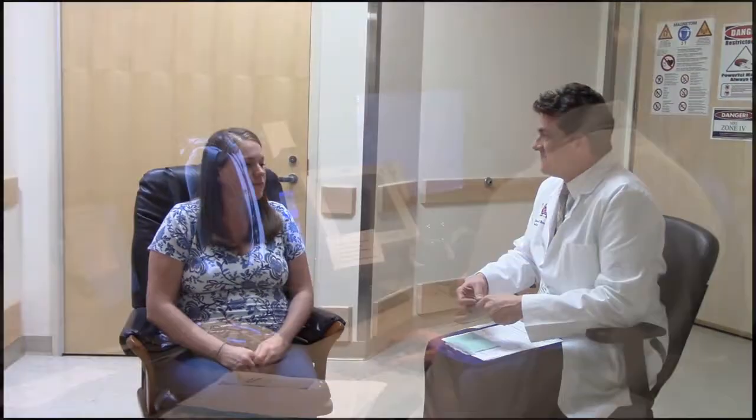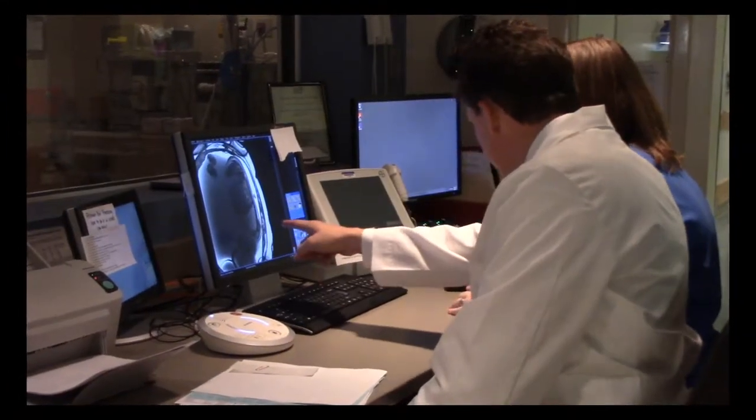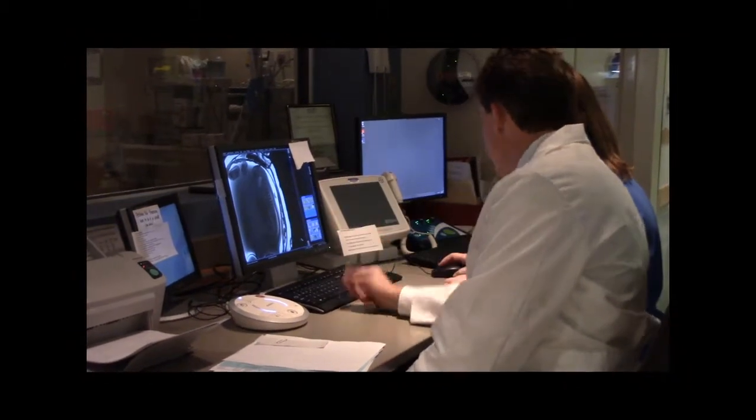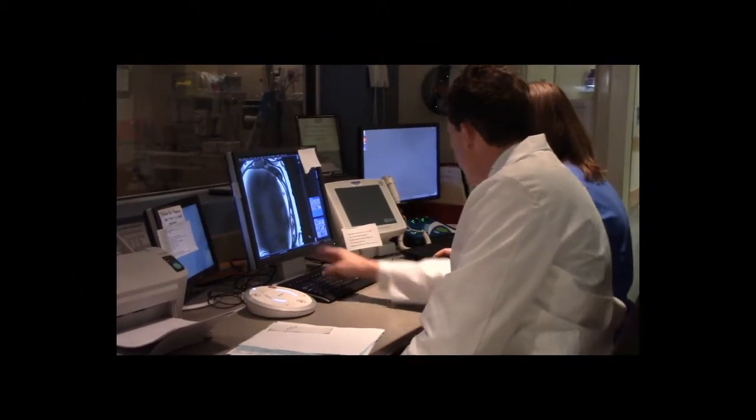Not having an MRI performed would be the alternative. However, given your particular pregnancy, your doctors feel it is necessary to further evaluate your baby before he or she is delivered. This would allow them to prepare in advance for any procedures necessary once the baby is born, to better counsel you regarding your baby, or even to offer the possibility of intrauterine procedures before birth.